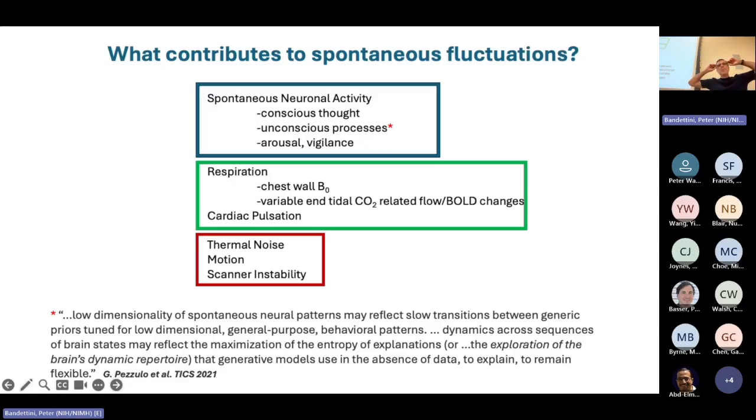And the thing is, and this is sort of an ongoing mystery as well, fMRI is very practical. We're using resting state fMRI all the time, and we use it for all kinds of things and make all kinds of inferences. We don't have a clue why it's there. We really don't. Why does the brain show this spontaneous correlation? But it works, so that's okay. So there have been more papers on explaining why it exists.